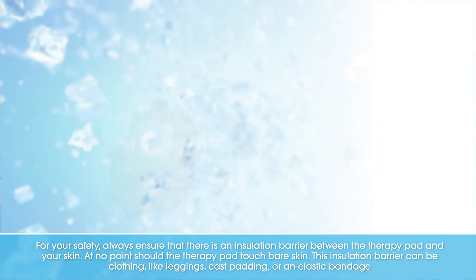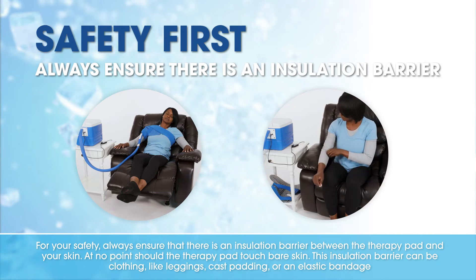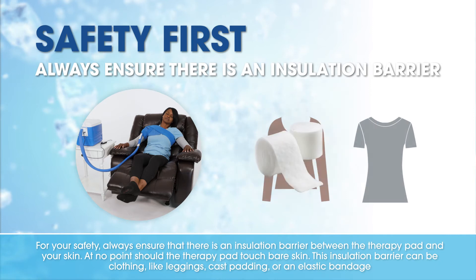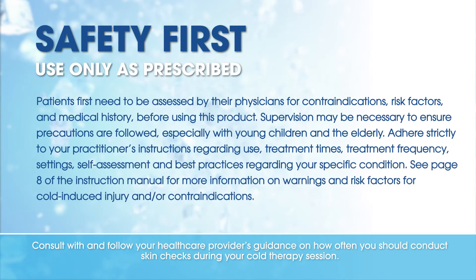For your safety, always ensure there is an insulation barrier between the therapy pad and your skin. At no point should the therapy pad touch bare skin. This insulation barrier can be clothing, cast padding, or an elastic bandage. Consult with and follow your healthcare provider's guidance on how often you should conduct skin checks during your cold therapy session.